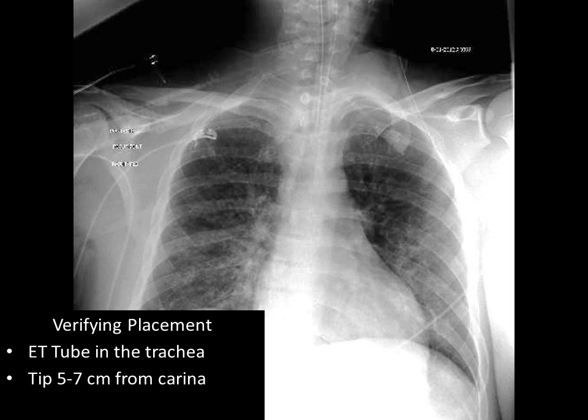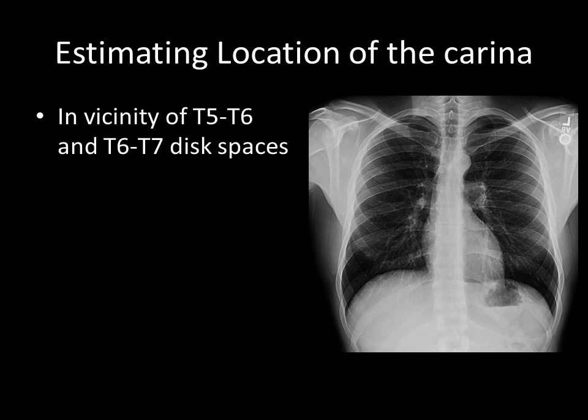A chest x-ray is often taken to verify placement after the ET tube has been placed. You want to verify that the ET tube is within the trachea by seeing that the ET tube overlies the hypodense column of the trachea. You're also going to want to verify that the tip of the ET tube is within 5 to 7 centimeters of the carina. Sometimes the carina is not visible in a chest film; you can approximate its location by looking for the T5-T6 and T6-T7 disk spaces.